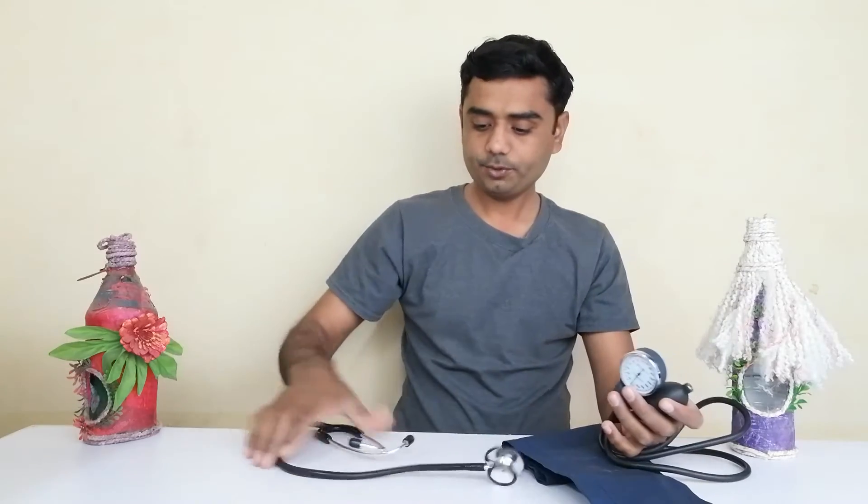For this purpose we need a sphygmomanometer — this is a sphygmomanometer. And secondly, we should have a stethoscope. These are the two things we need.